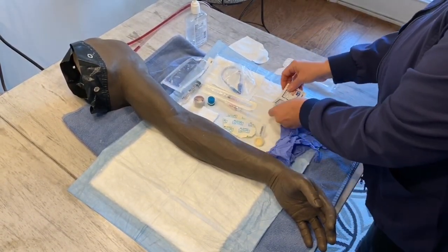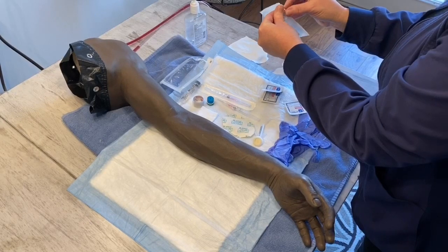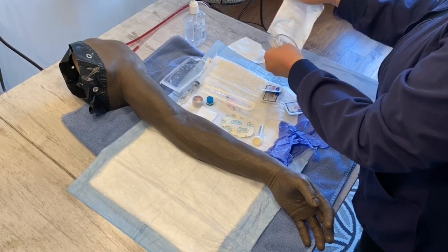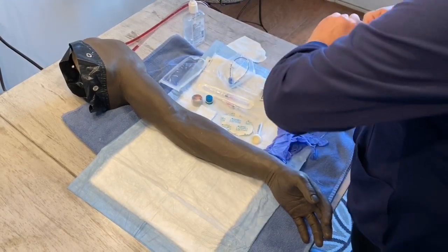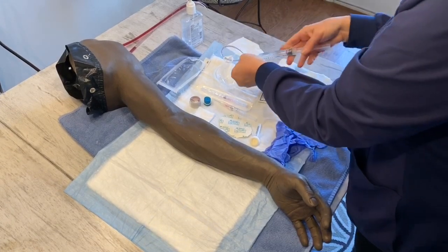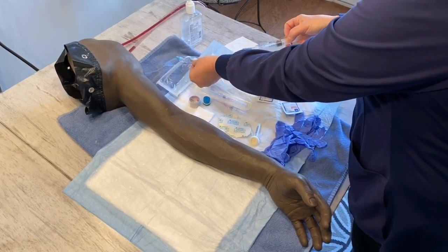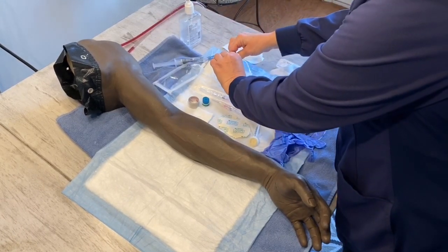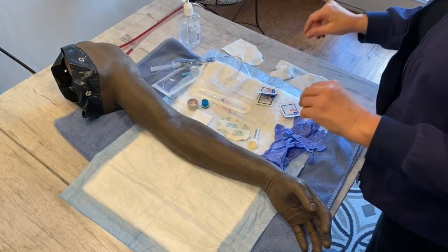I have my gloves, I have an alcohol wipe, and I have my extension set that I want to go ahead and open at this time. And I'm going to go ahead and flush and prime that set. You'll see some water drip out, and that's perfect. The other thing I like to do is loop up because I'm by myself. I go ahead and uncap this and lay it back into the container that it came out of. That'll keep it clean and aseptic.